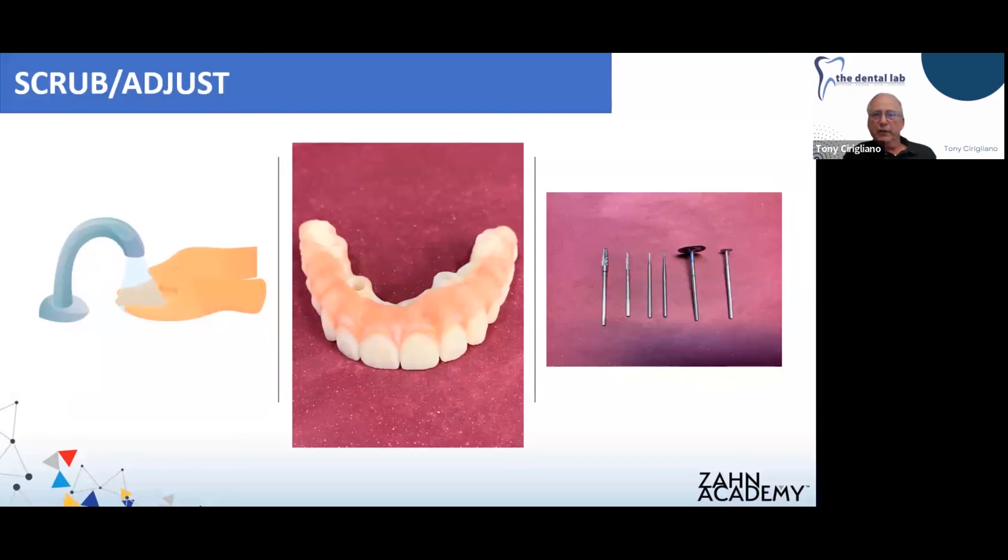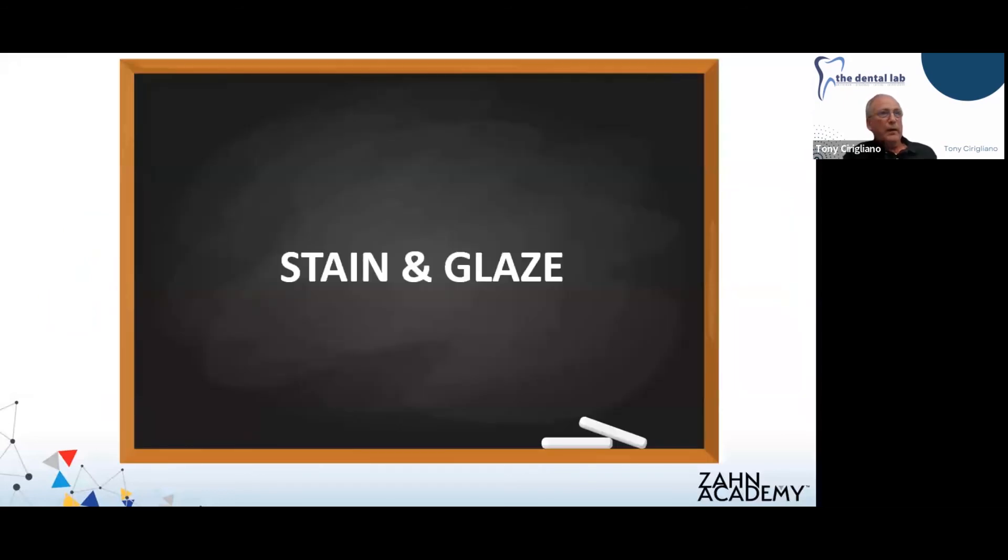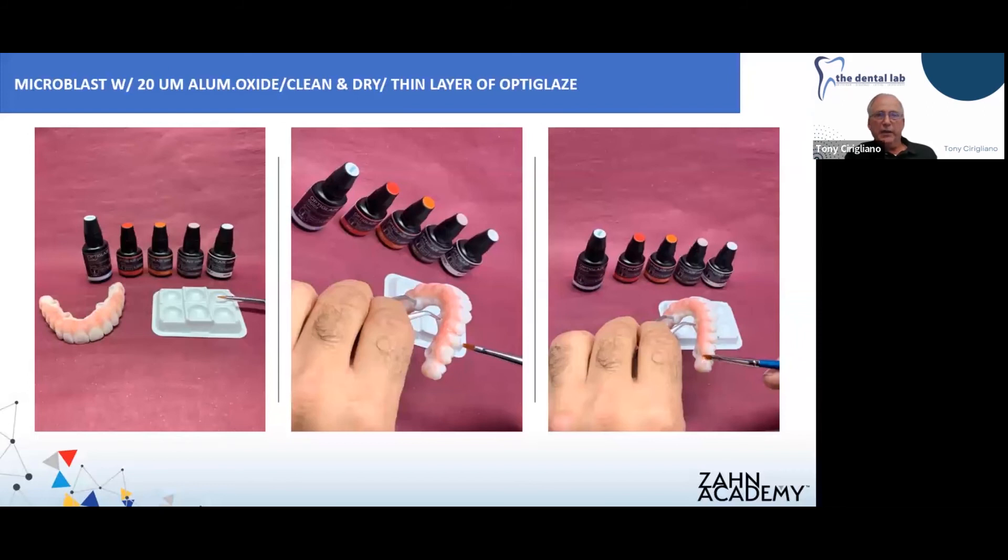We're going to finish the Gradia material with our standard carbide burrs and disc, and get it ready for stain and glaze. Once all our finishing is done, we're going to microblast with 50-micron aluminum oxide, clean and dry it, and apply a thin layer of optic glaze to the whole surface — both teeth and pink.